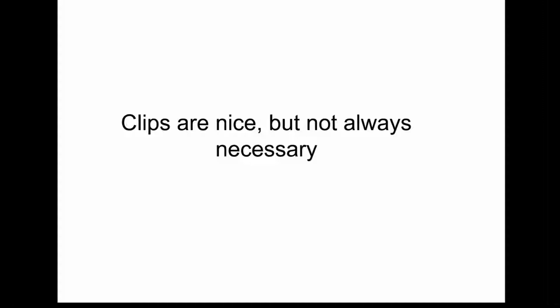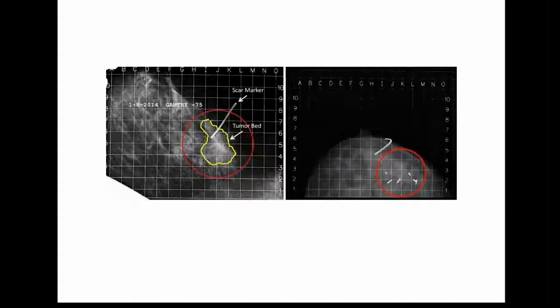As I noted earlier, having clips is nice but not always necessary. Next slide. And we have found with experience, and not much experience, but we now have a pretty good eye to identify where post-operative changes are on these image guidance films. So the clips are advantageous, and you can even see in the right-hand panel, clips have been left by the surgeon, but you can still see the post-operative change pretty readily even without the clips. So clips are not always necessary for targeting. Next slide.